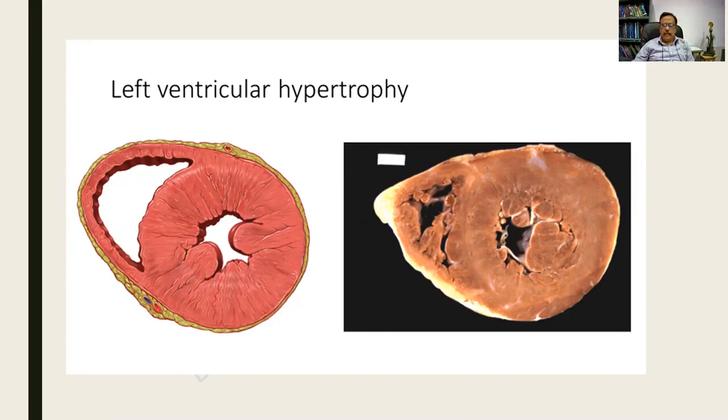In your examination, you are supposed to measure the walls of the specimen, diameter of the lumen, wall of the right ventricle as well, and the lumen. Now look at this. It is a specimen from an autopsy, and I find that the right ventricle is over here, the left ventricle lumen is narrowed and it is markedly thickened. Again, an example of concentric hypertrophy. So you will not be wrong if you say it is an autopsy specimen, because no man will be alive after the heart is removed.